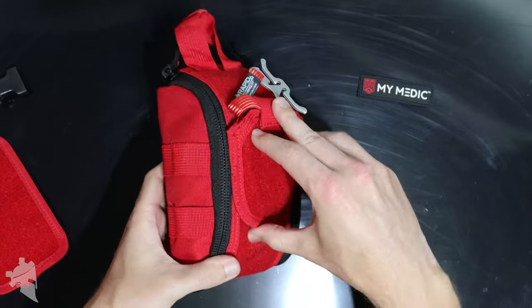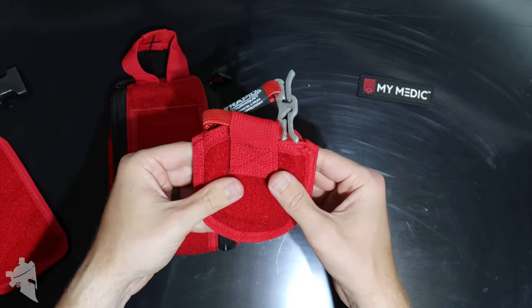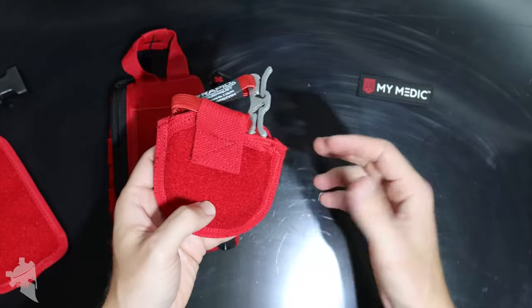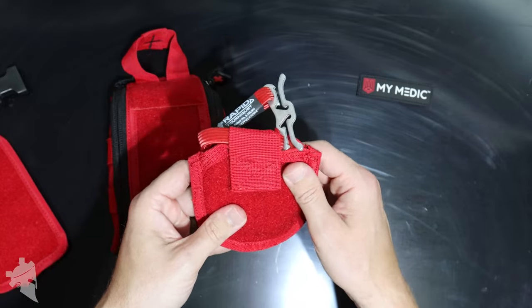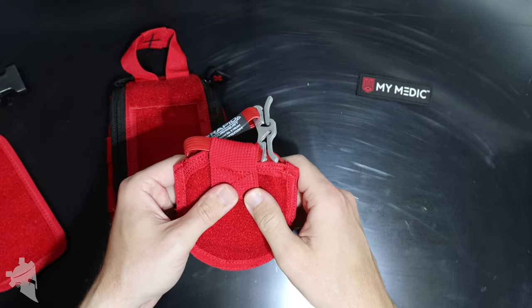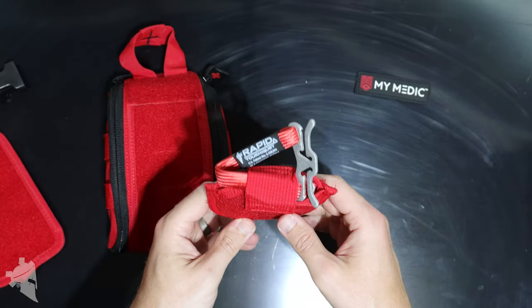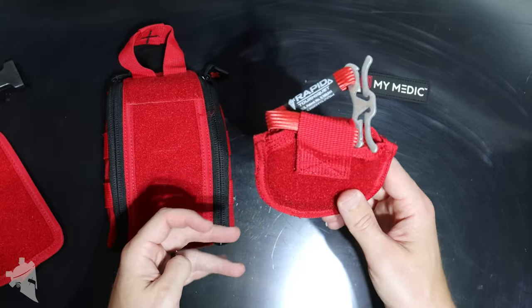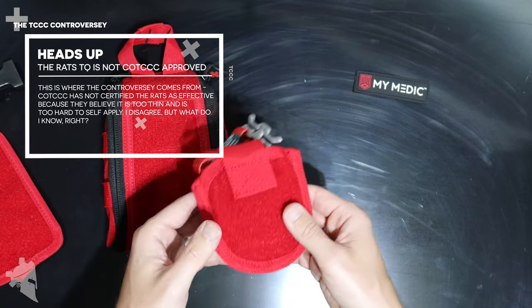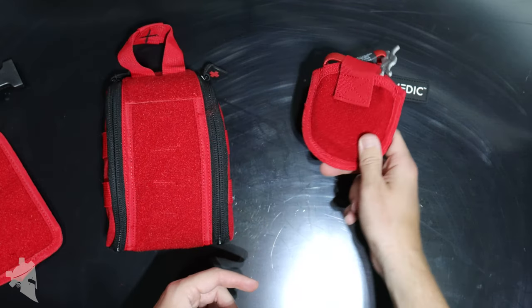On the front of the pouch there's another detachable pouch which holds a RATS tourniquet. If you want to learn more about the RATS tourniquet — how it works, how to use it, and why I personally have been carrying one every single day since I made the video — I'll leave a link. The world seems divided on the RATS tourniquet: some people love them, some hate them. Honestly, if a Green Beret 18 Delta Medic designs something specifically for a medical purpose, that's good enough for me and why I personally carry one. Detachable tourniquet pouch — there you go.